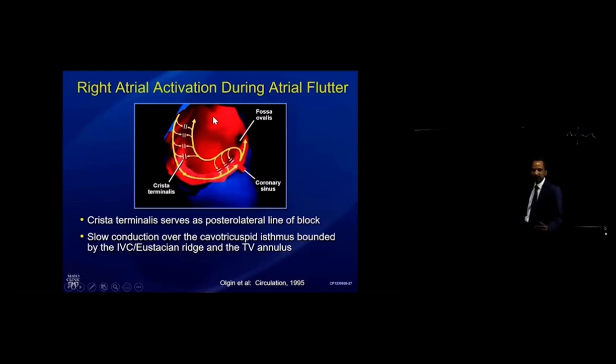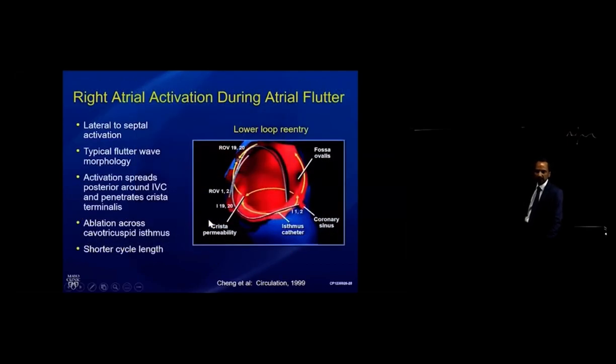This is important to keep in mind because we may entrain tricuspid isthmus dependent flutter at some unusual sites when we're not certain of the etiology of the flutter, and then focus our attention in that region when we could have had a much simpler solution with our own usual cavotricuspid isthmus flutter.